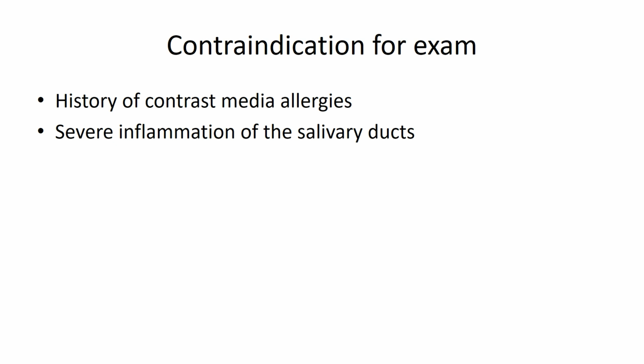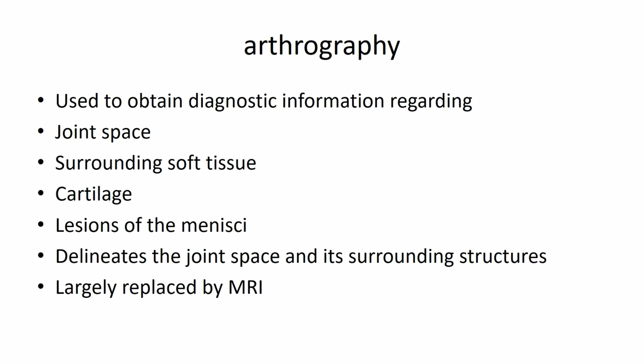Contraindications: whenever we are using contrast media, it is important that we understand the history of the patient for any kind of allergies. If the patient has been given or tested with any contrast agent earlier, we should know the history of allergies, because a severe inflammation could always be witnessed with some of the agents, especially with the iodine compounds or iodine compounds prepared in oil base.